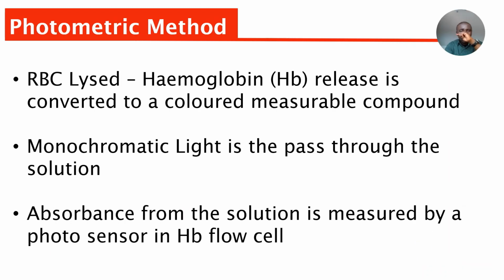So now let's look at a little bit of detail, because I'm trying to give you this gradually, so that at the end, we're going to try to find a way to summarize this. But let me give you another side of this. So we've known photometric for hemoglobin. We've known electrical impedance. We've known flow cytometry in terms of differential white cell count.